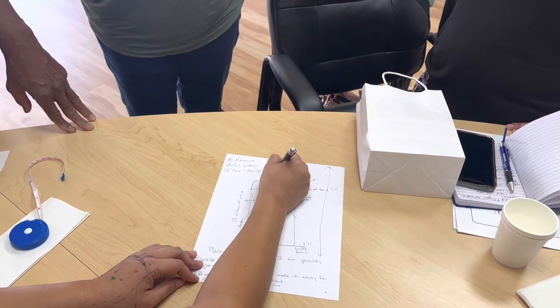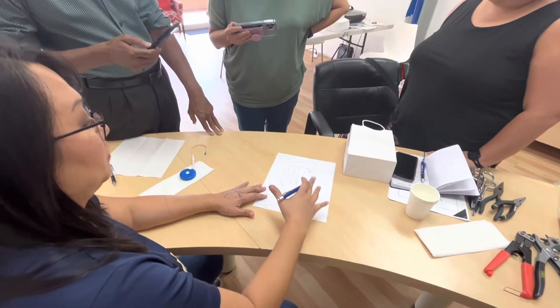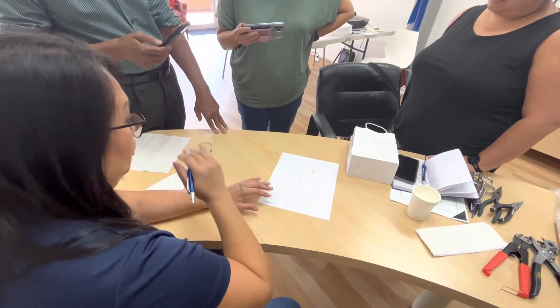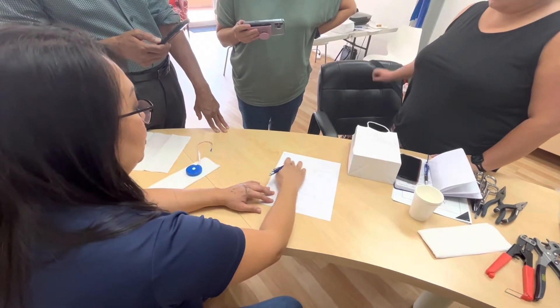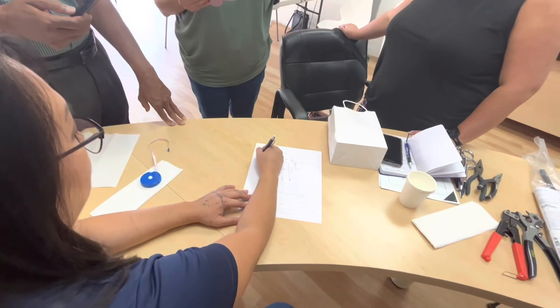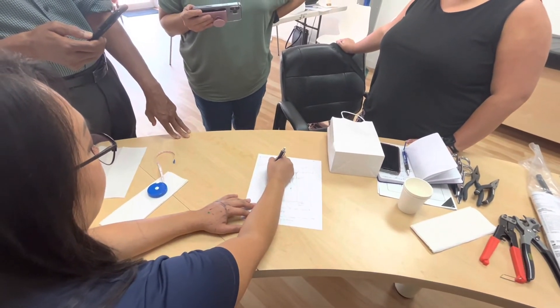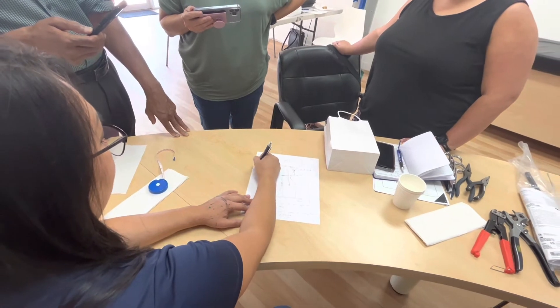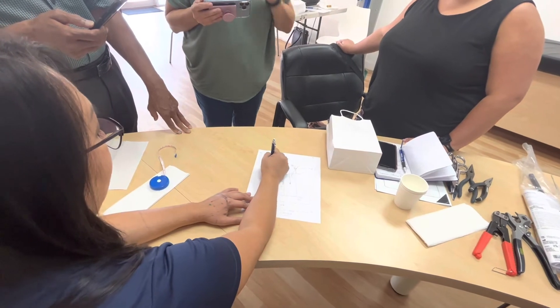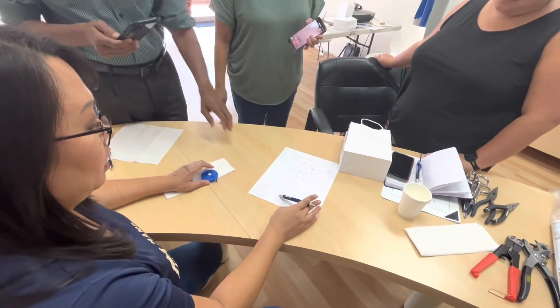You always want to trim everything first before your final placement. Place for the idea of trimming, mark your material, finish trimming, and then do your final placement. Let's try it out.